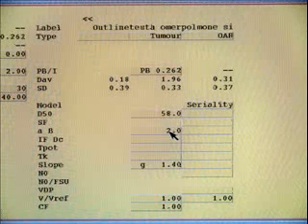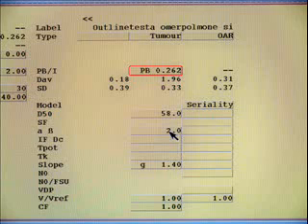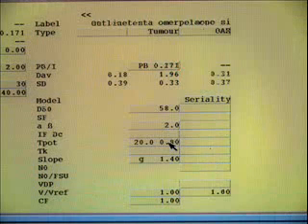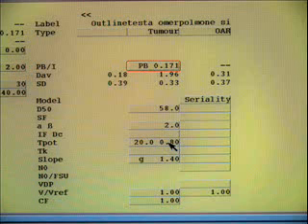It is possible to apply, for example, an alpha-beta correction value to account for fractionation. After entering the alpha-beta correction, the TCP value is automatically recalculated. Similarly, the potential doubling time of tumor cells and the accompanying cell loss factor can be entered. Upon entry, the TCP value is again automatically recalculated.